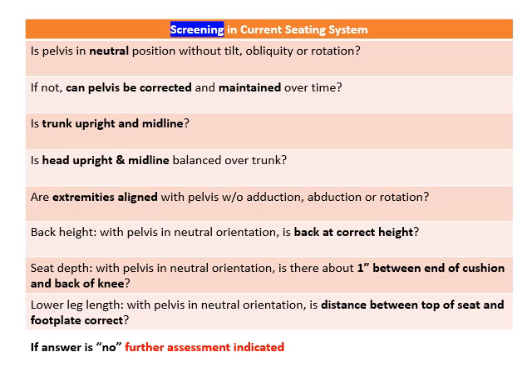Regarding the back height, with the pelvis in a neutral position, is the back at the correct height? You will see people sitting in wheelchairs that have a very short back if you've got adequate trunk control, and of course depending on the type of mobility system that they need. There are people who've got a lot of back support with a very high back. So it just depends on what the client needs.